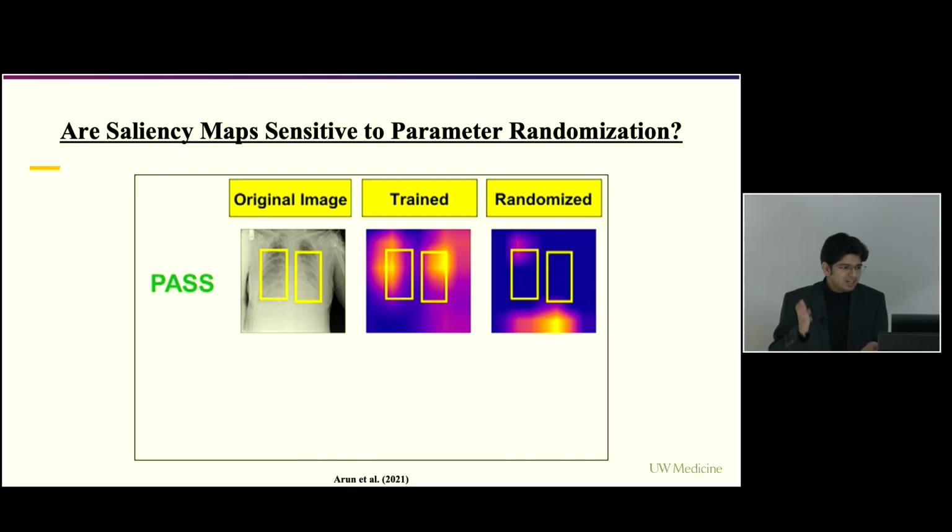So now this is a random model, and we see that it is picking up on random imaging features on the image. So it appears that this trained model does an amazing job compared to a flip of a coin. Not only does it have amazing AUCs, but it also has an interpretable and clinically meaningful inference mechanism.